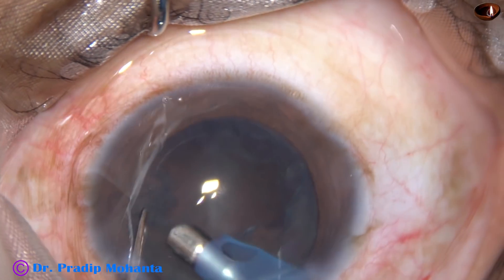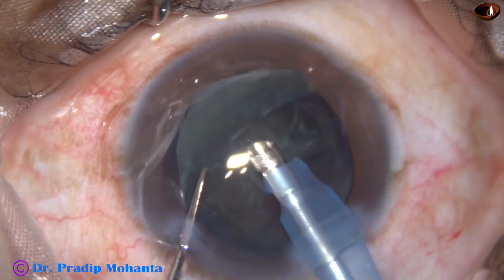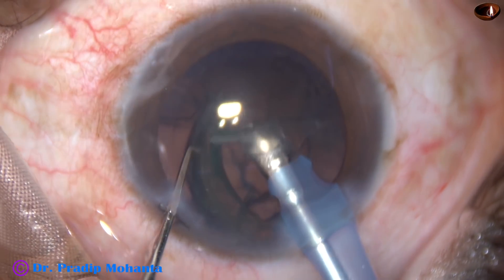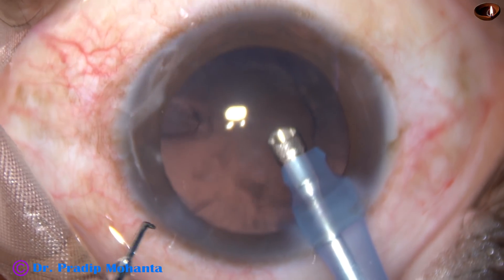You must be very cautious at this time. Very minimal vacuum should be used. The foot control should be managed carefully, and the epi-nucleus is removed.